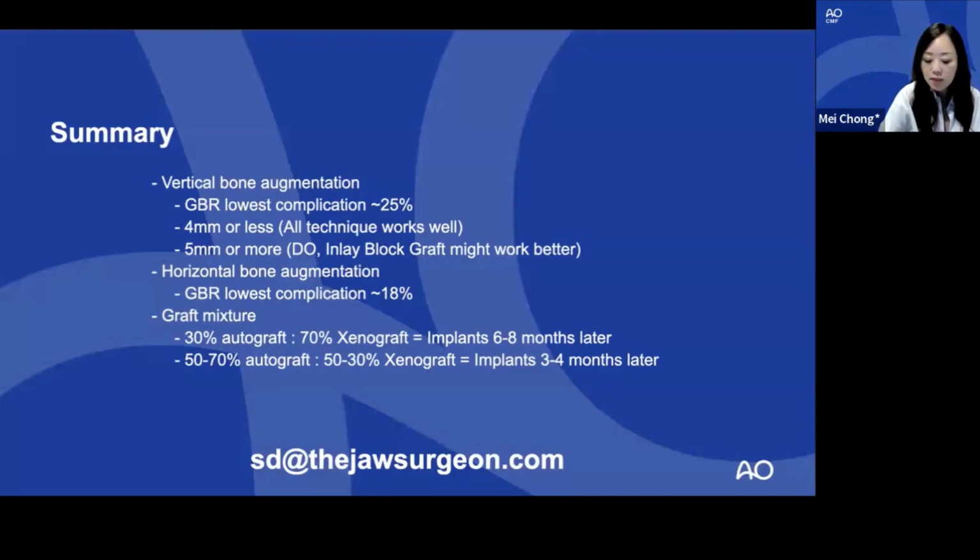Do you encounter any difficulties with getting bone graft in the palatal area? Do you have to raise the palatal flap a little bit wider, or any bleeding or hematoma, or post-op precautions that you take for these areas of grafting?